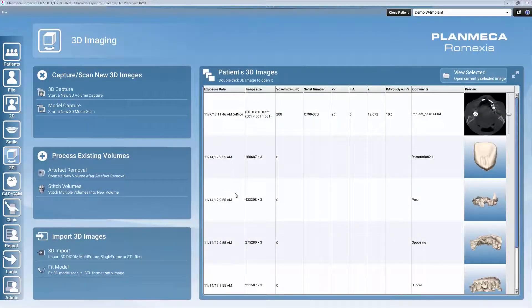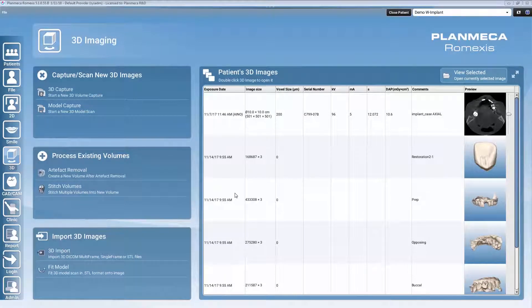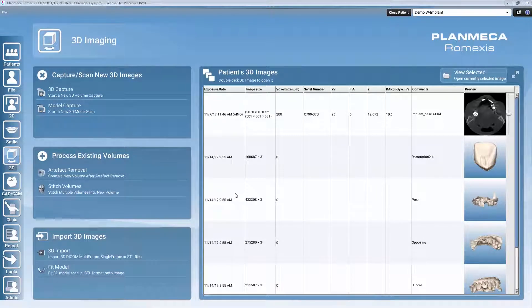Hello everybody and welcome to this PlanMeka Romexis implant planning workflow video. In the next minutes I will be showing you how to do implant planning in PlanMeka Romexis software and how to finalize it in your own designed implant guide that you can do even chairside.